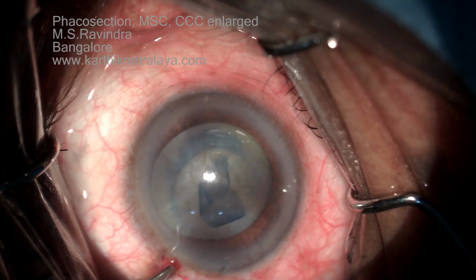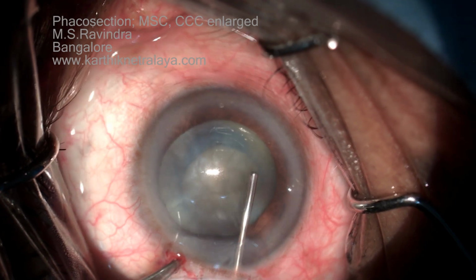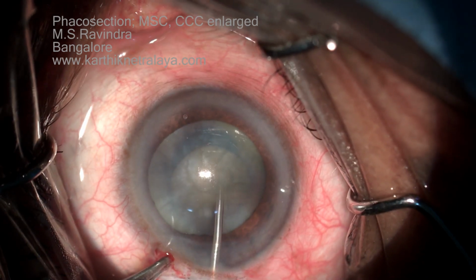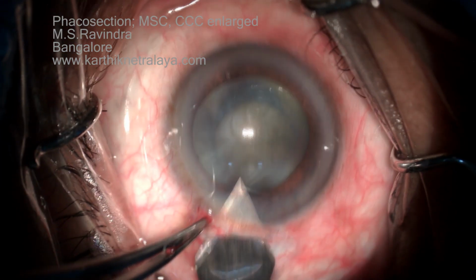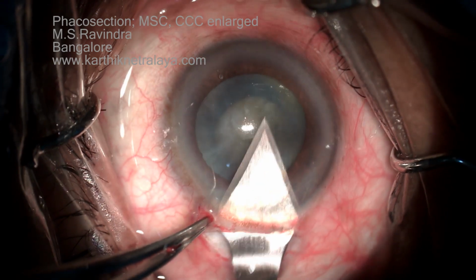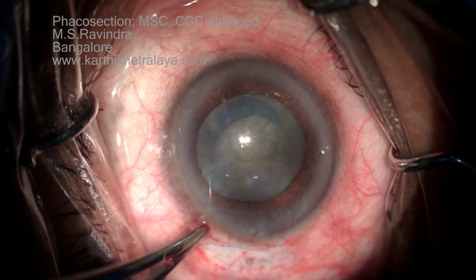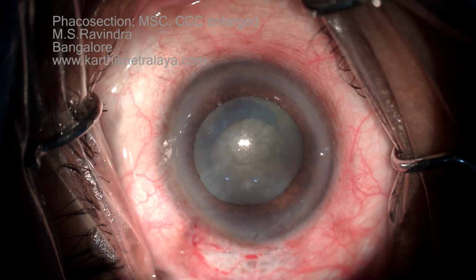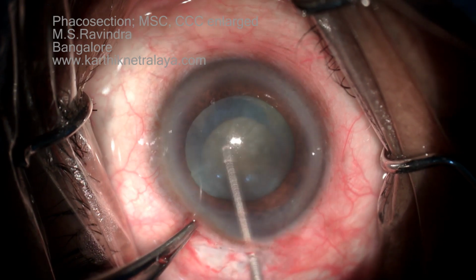A quick rexis is made, which is slightly eccentric and smaller. Lignocaine is applied into the anterior chamber under the coat of viscoelastic. The tunnel is enlarged to about 6 to 6.5 millimeters because I expect this to be a hard nucleus. No hydrodissection is done.